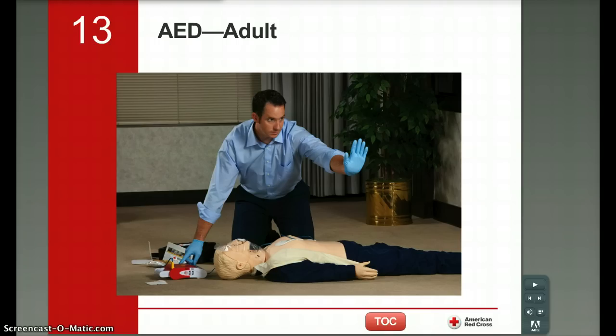More often than not, CPR has already been started. Somebody has gotten an AED, they brought it to the location where the victim is at. As soon as the AED arrives, you would stop performing CPR, immediately get the AED hooked up, and let the AED do its job.